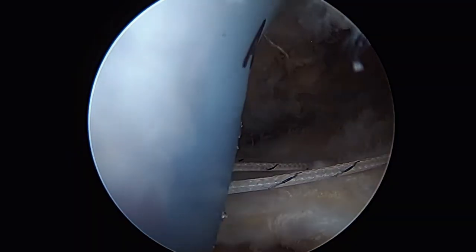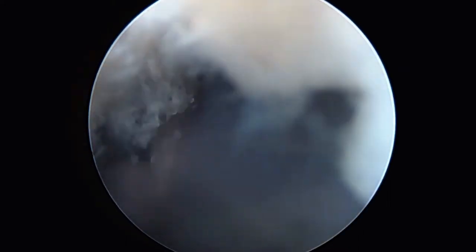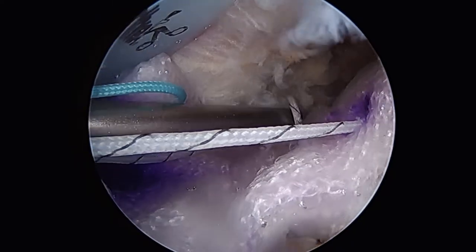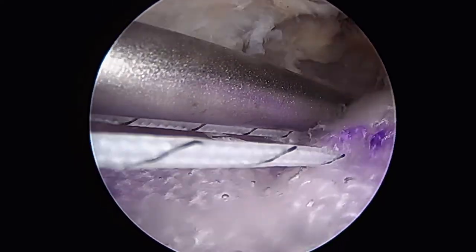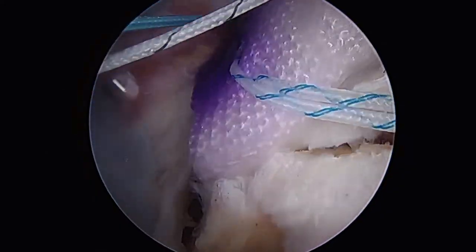The graft can then be easily placed down nearly any cannula and slid into the subacromial space on top of the supraspinatus rotator cuff. The graft's medial sutures, which come through the rotator cuff and the graft, can then be tied down to provide fixation medially.